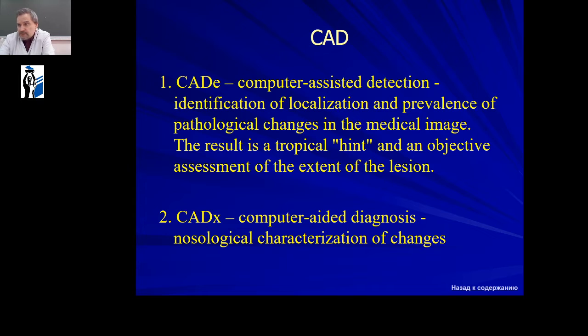If imaging and radiation diagnostics are faced with a large-scale task of evaluating hundreds, thousands, or more images, then other processing mechanisms are required: a higher degree of reliability and speed than the work of a single radiologist. To solve such problems, the use of computer diagnostic support systems is required.